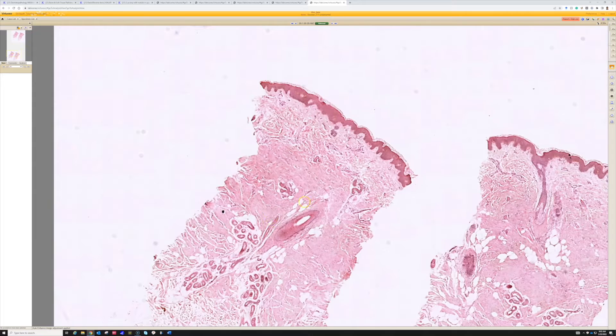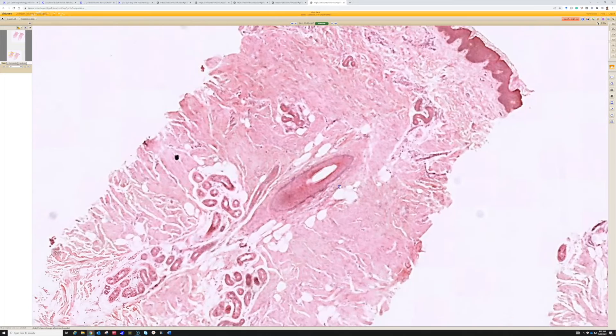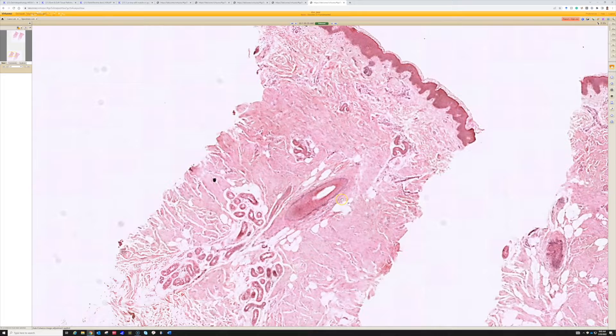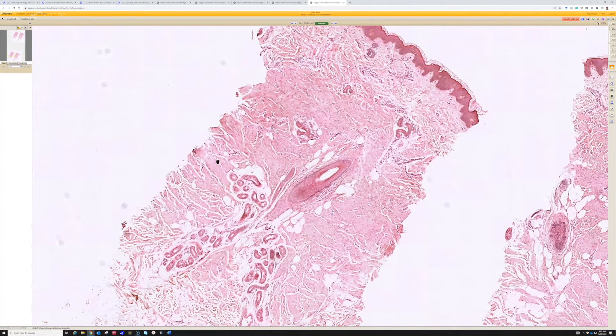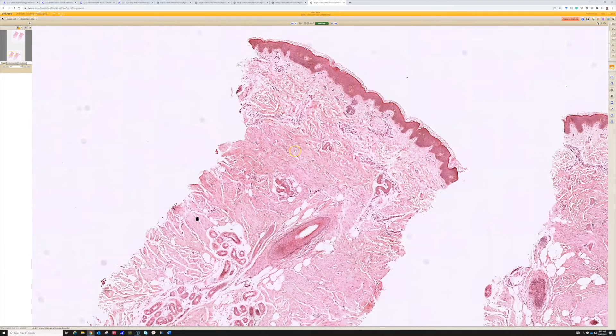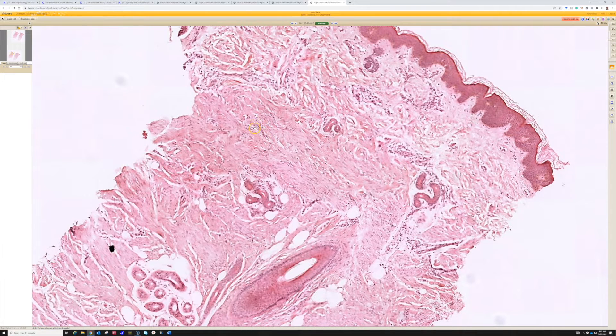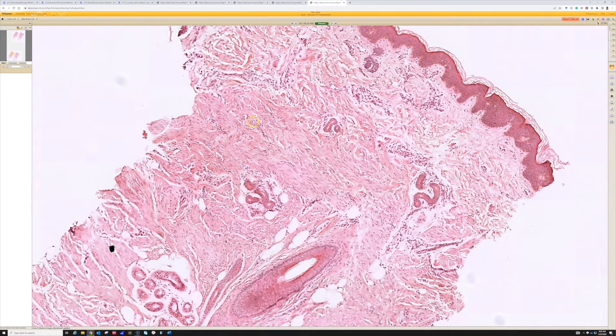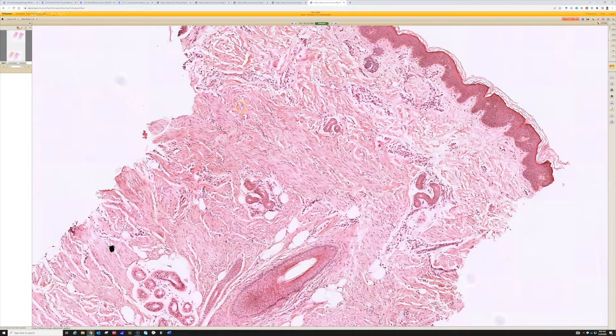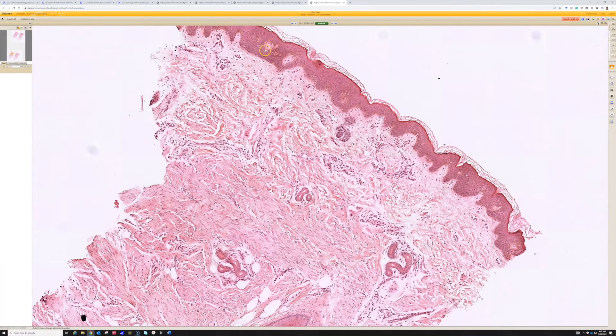And what we have are, let's go over to this side, unfortunately it's kind of got a crooked angle here, but I think you can still see we've got bland fibroblastic or myofibroblastic cells running in nice organized fascicles, and these fascicles are running parallel to the epidermis.